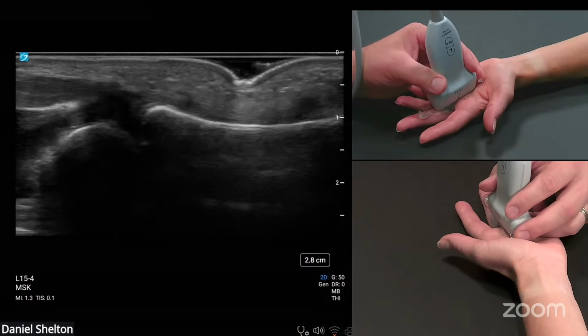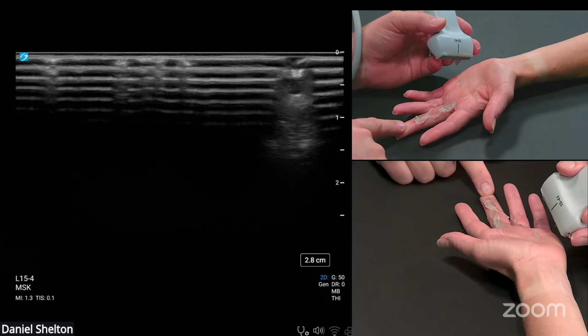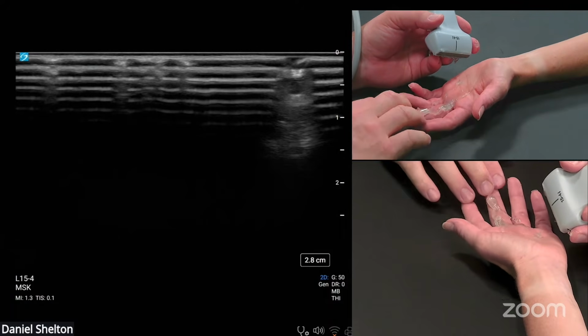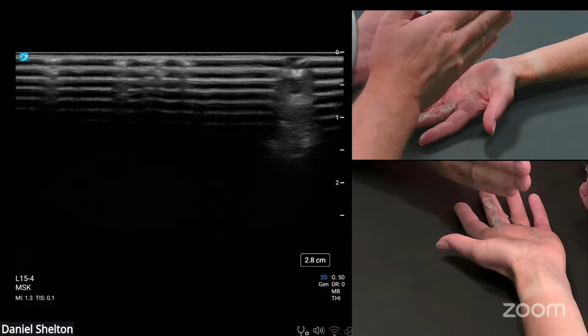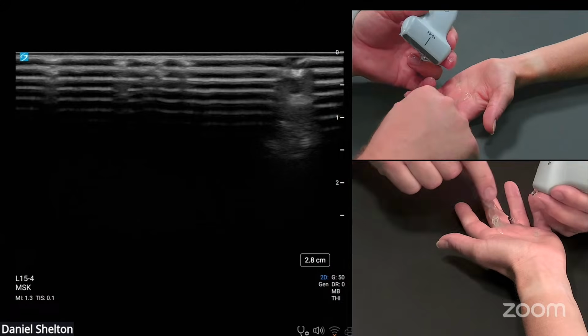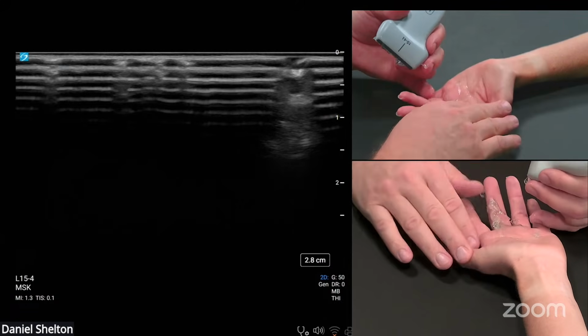First, let's identify the bones. I like to stay in the third. I'll tell you why. When I'm teaching this or showing somebody, if you stay on the third, it keeps the bone relatively in a straight line. Whereas if I'm on the second or the fifth, the bones kind of take a curve this way, and the tendons definitely take a curve this way.